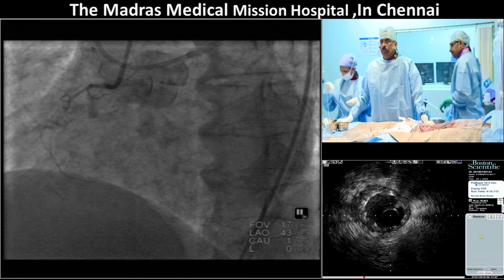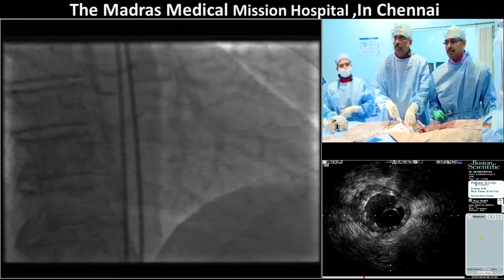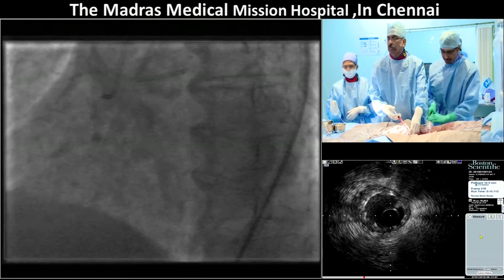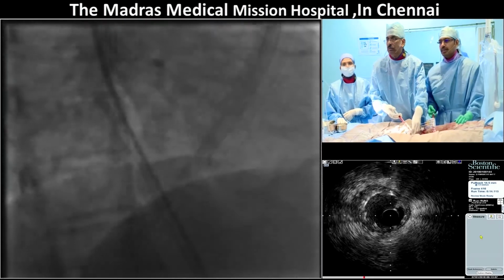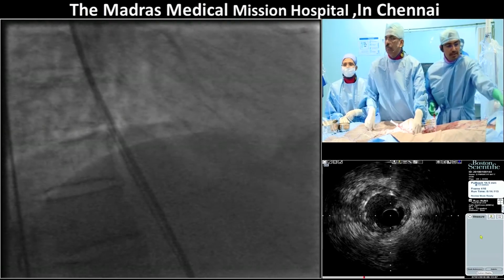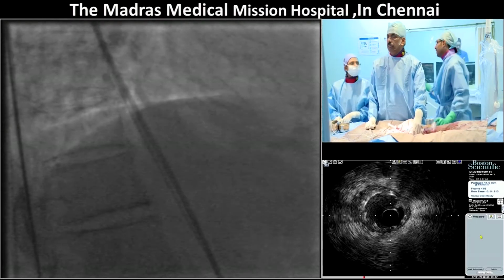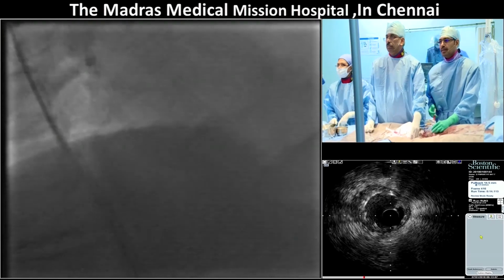Ajit, can you take a lateral view? Will that help? Yeah. Sure, I can try to take a lateral. Okay, so we're trying to get a lateral for you. Okay, that's good. Yeah, just get the top out. Can you move the center of the catheter position? Sister, get a micro catheter. Micro catheter, Gaia 2 wire. Okay.